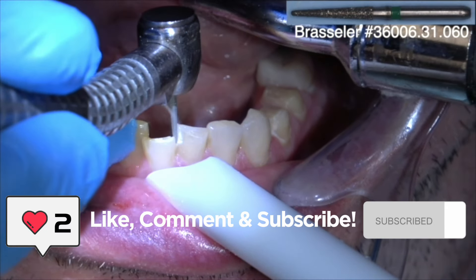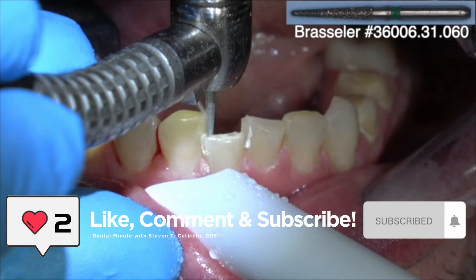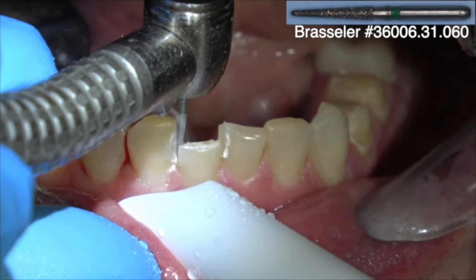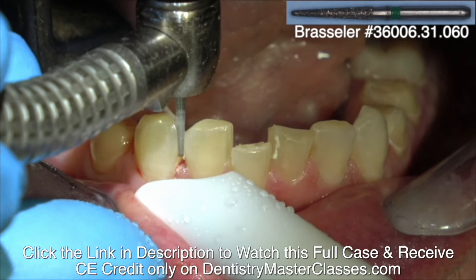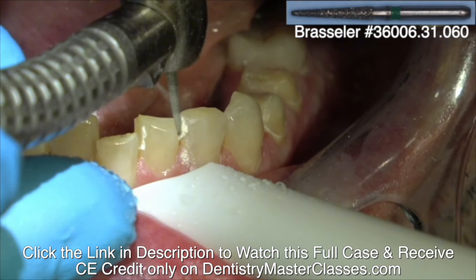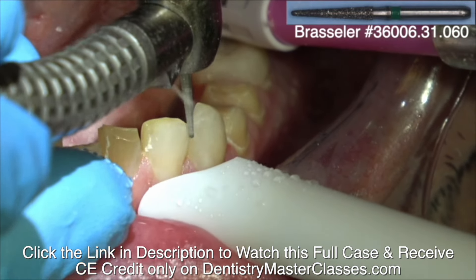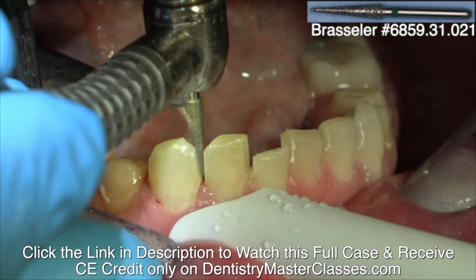If the teeth are not too crowded, you can place veneers on the teeth without orthodontics, as long as they're not way out of the arch. I first cut between the teeth — I like this burr for that. You have to keep a steady hand and just go straight through to be sure everything draws. It's very important that you include the interproximal surfaces; that's called wrapping.